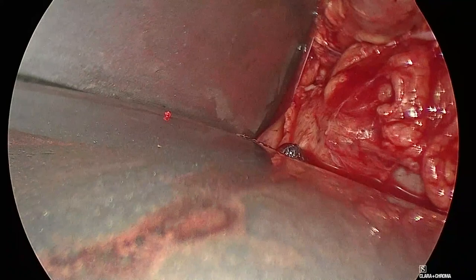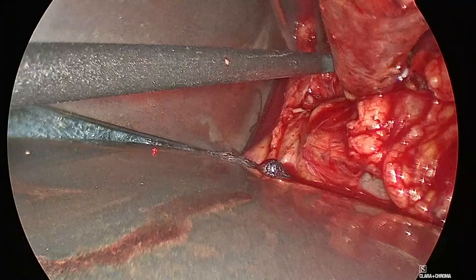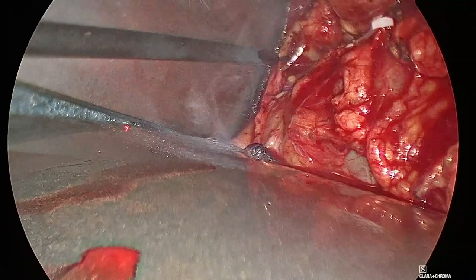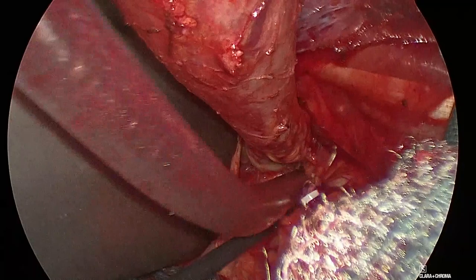Okay. Did you feel the bladder? Yeah, I am at the bladder there, but I want to dissect a little bit more to show you. But it's very sticky here. When did the lady have the ureteroscopy? You know that? No, we don't actually here. One month ago. It's very sticky. But we will get there.